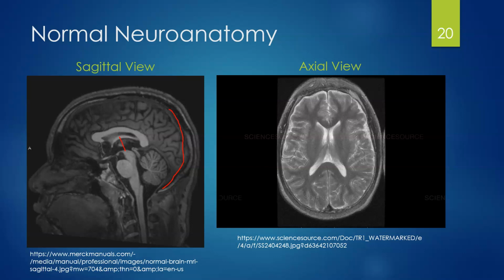We come back to our axial view. We got those nice, healthy-looking gray matter and white matter tracts. Our ventricles are symmetrical. They're full of cerebral spinal fluid. They're the right size, so we don't see things like hydrocephaly. Nice and clean and equal on both sides.